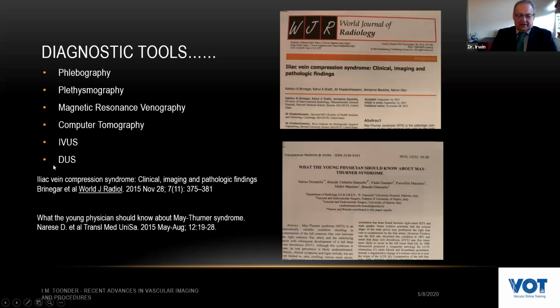And duplex ultrasound. And sadly, in these two papers, when we are talking about duplex ultrasound, it's being said, no, well, it's very user dependent, and it's not quite sensitive, and we shouldn't really use it. It's cheap, it's commonly available, but really it's not that popular, which is, in my opinion, quite sad, because I feel that duplex should be, in the proper hands when we're teaching each other the proper skills, should manage with duplex. But both papers recommended other examinations rather than the duplex.